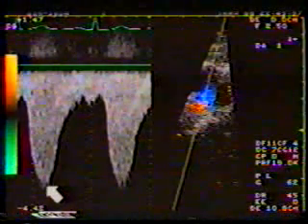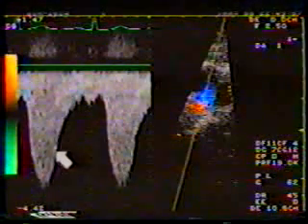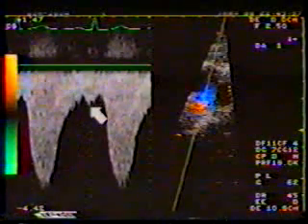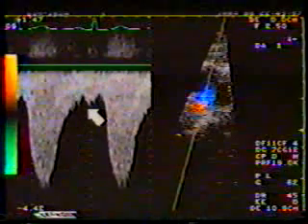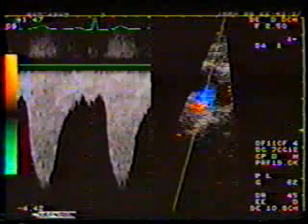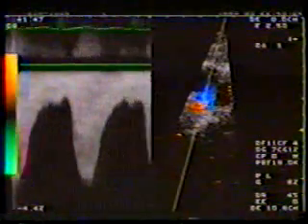The peak velocity is 3.7 meters per second, and observe that these velocities extend throughout diastole into the next systole. This is indicative of the presence of severe degree of obstruction. Observe this in real time and also listen to the characteristic audio. This case example is representative of our experience with coarctation in adults and underscores the value of continuous wave Doppler.